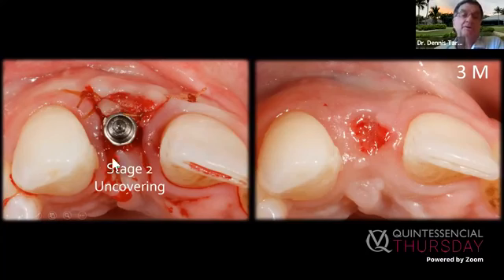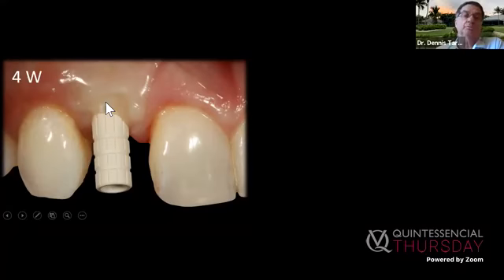The biggest problem is uncovering these without touching the papilla, because it's so far forward. This creates an opening here, and you don't put a temporary on. Put the flattest emergence profile you can, the straightest, flattest abutment you can find, because these can't close, because there are no elastic fibers in the attached gingiva, and that's what the problem is here. So you push that out.